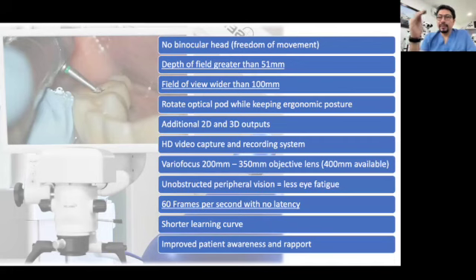You can go even for the fourth level of magnification when you want to polish a margin, for example, that is close to the gum. But the fifth and the sixth step of magnification are only for removing broken files, or checking if you have a fracture, for example, just for very specific procedures, not for everything.